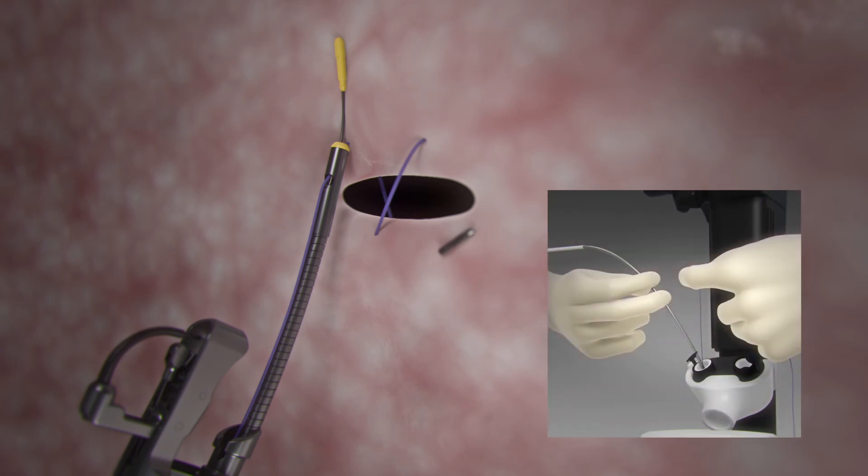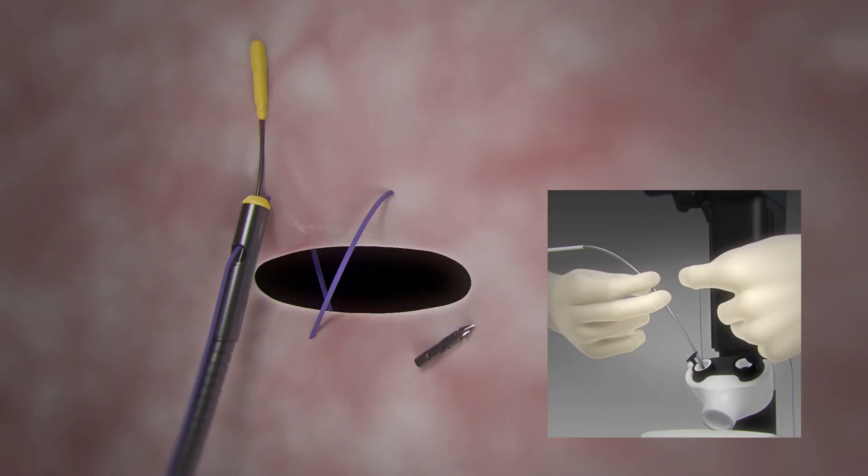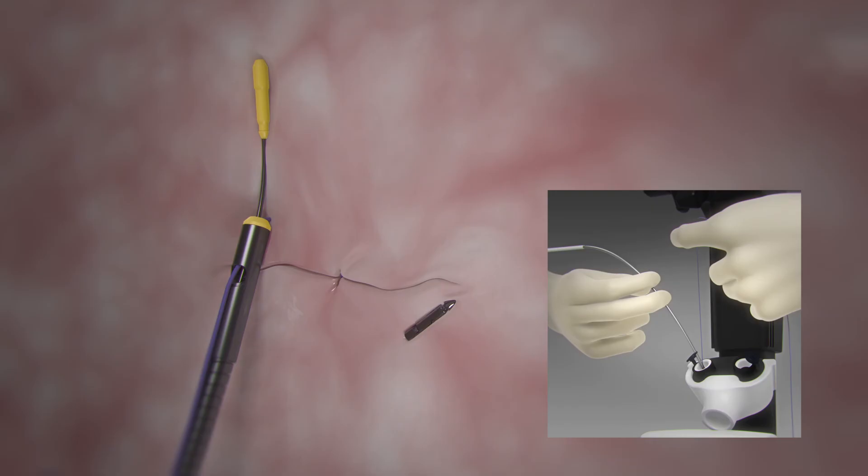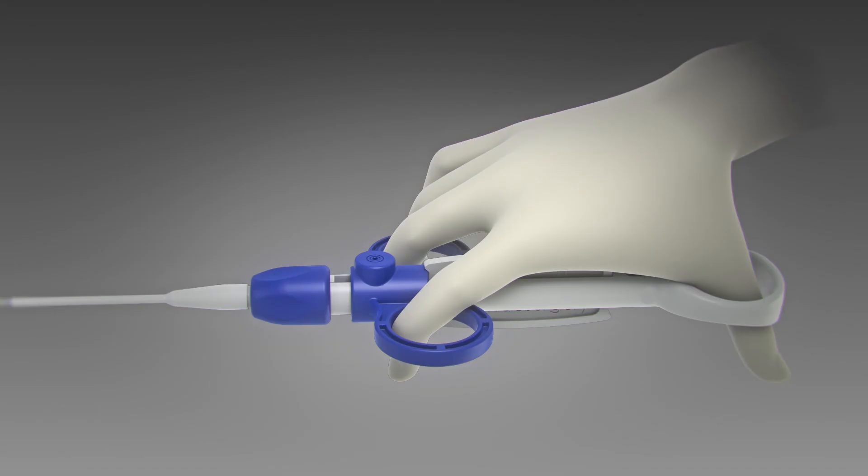While holding the cinch catheter in place, apply tension to the suture with small increasing increments of force. Care should be taken not to pull the suture too tight, resulting in breakage. Once the desired amount of tension is reached, open the cinch handle with the palm facing down. This will release the safety mechanism.